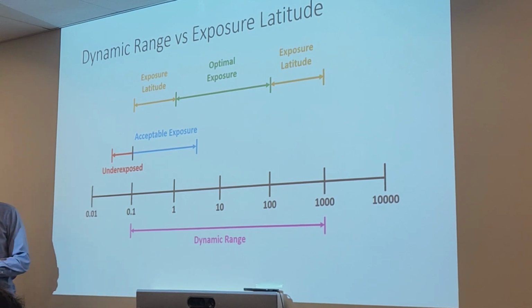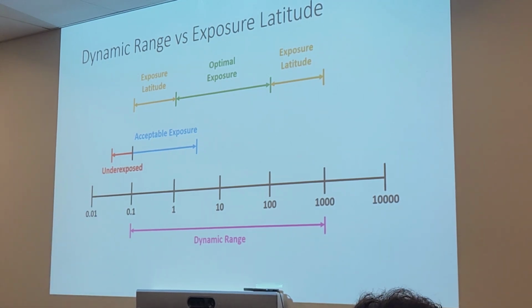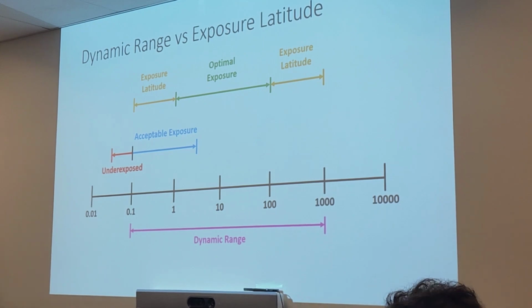And remember, with film screen, you didn't have as much wiggle room as you do here. The good thing about digital is that you do have a lot more freedom, a lot more flexibility. If you use the wrong technique, you don't need to repeat your image. It gives you the ability to adjust more easily. It's a good question, I suppose. Partly to understand the concepts of over and underexposure, and partly to appreciate how far we've come since film screen.